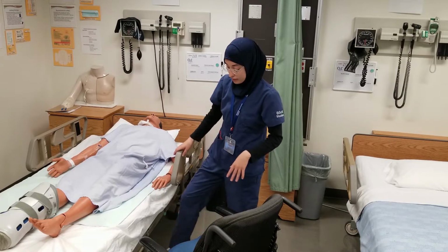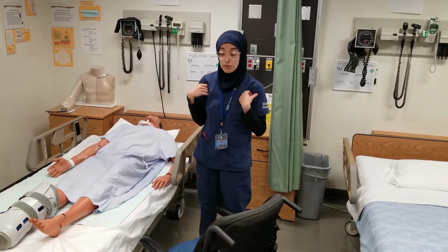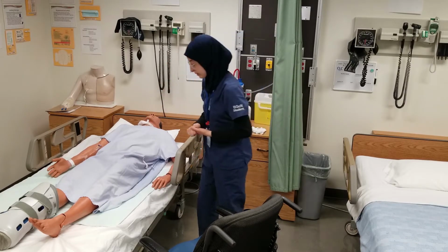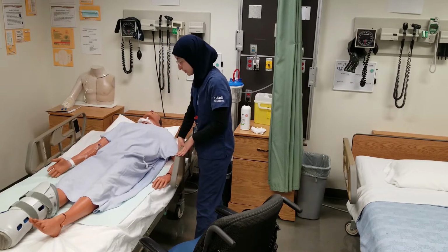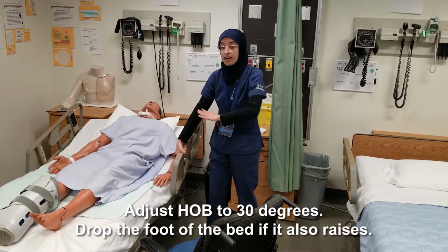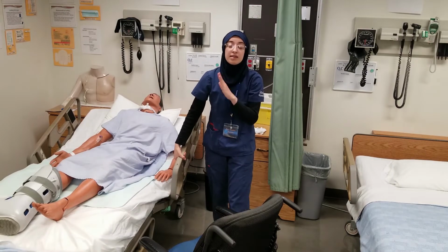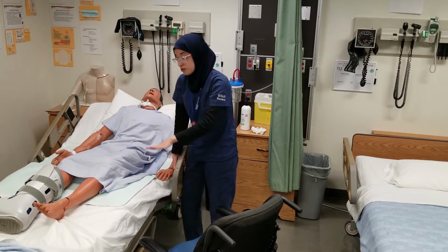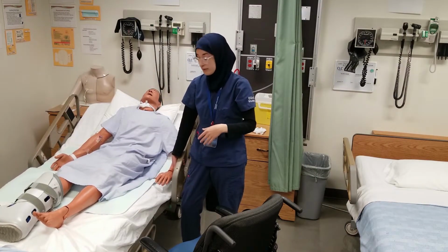Once that's done, I want to make sure that the brakes are set, because if the patient goes to stand up and the brakes are not set, the bed could move out of the way and the patient could slip and fall. So once that's set, I'm going to move the head of the bed to 30 degrees. If you're unable to estimate, you can also take a peek at the bottom where it has how high the bed is. I also want to make sure that I'm dropping the foot because the foot sometimes automatically comes up when you're moving the head.